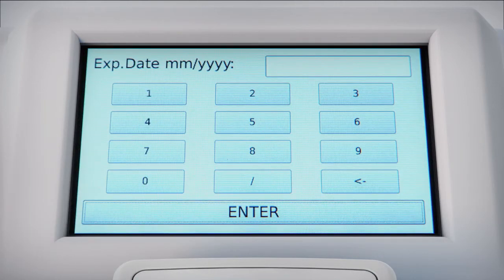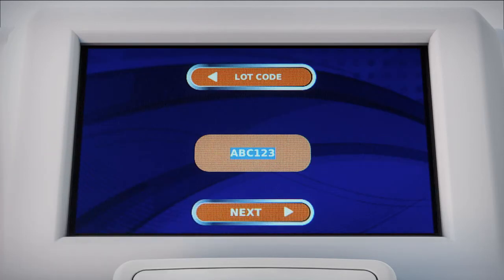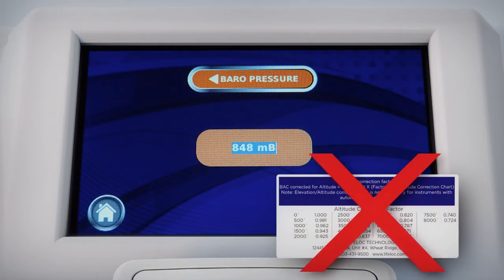Communication between tester and calibration station allows for storage of the event and synchronization of calibration standards. On-board barometric pressure sensors automatically check and set the altitude correction factors, so there's no chance of error, allowing the EZ-Cal to go anywhere you need it to.